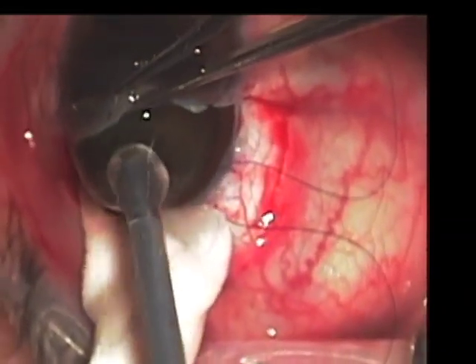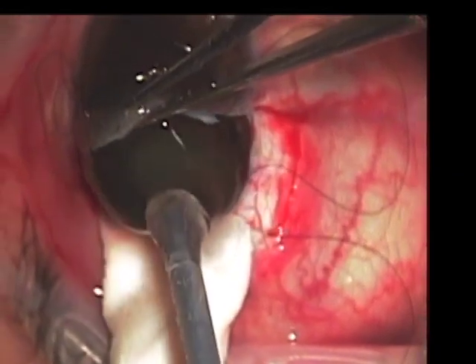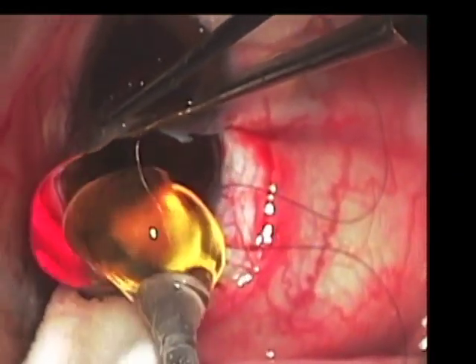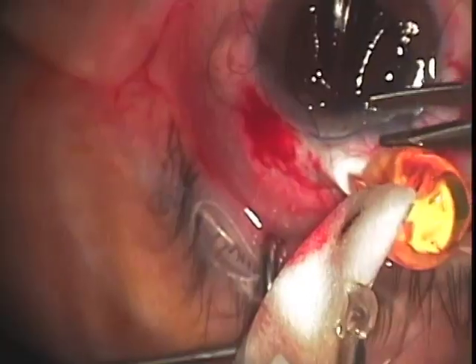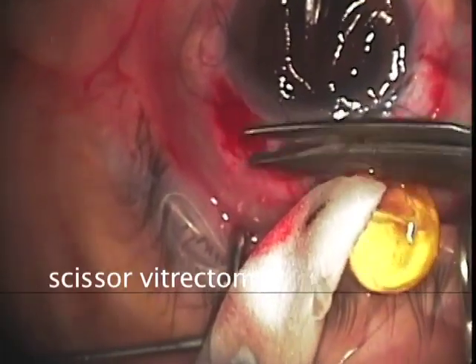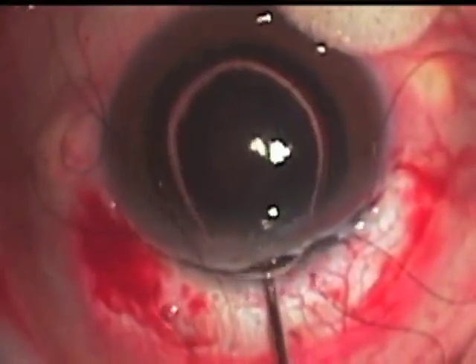The surgeon next rocks or moves the lens back and forth in order to loosen zonular attachments while slowly removing it from the eye. Next the vitreous attachments are cut using scissors and we have an aphacic eye with some vitreous prolapse.